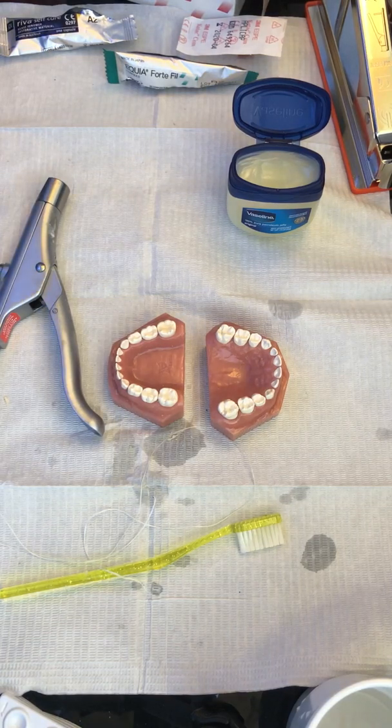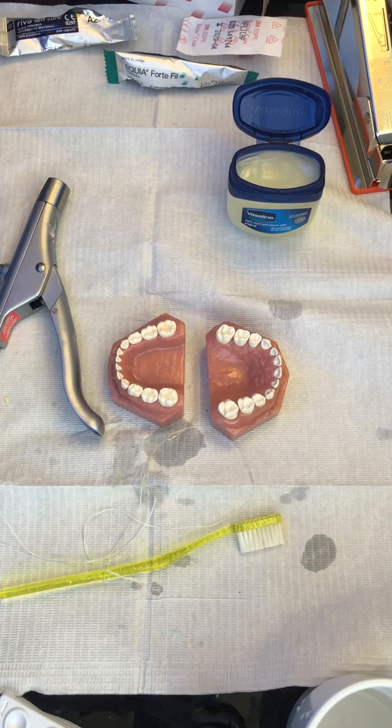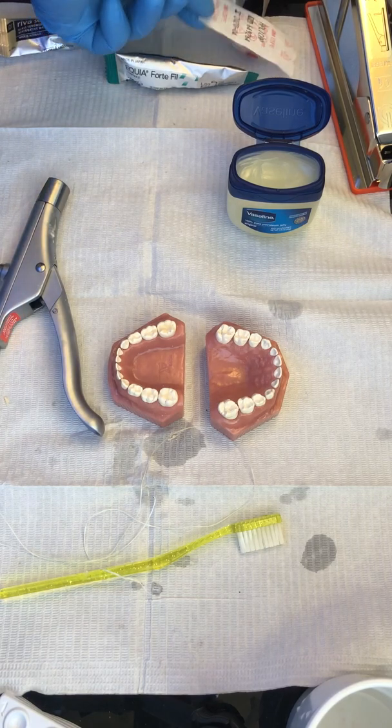Hey friends, we're going to use high viscosity glass ionomer to perform some dental sealants on the upper primary and permanent molars here of our six-year-old.